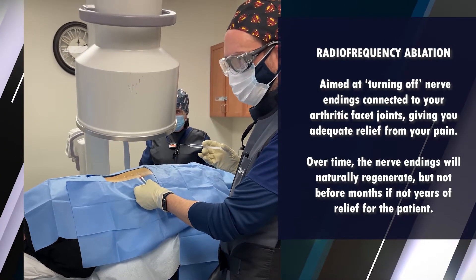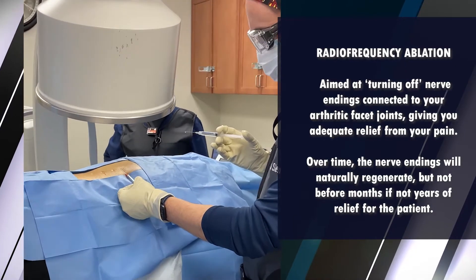At this point, local anesthesia has obviously been used to get the skin surface numb.